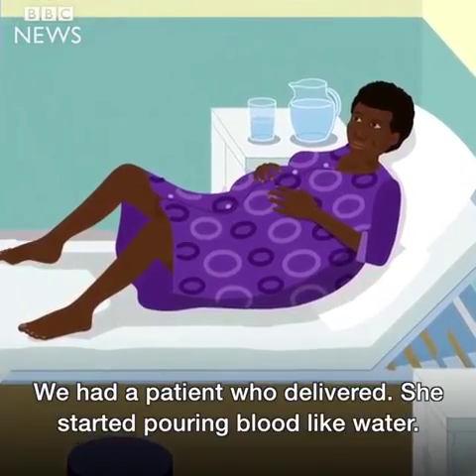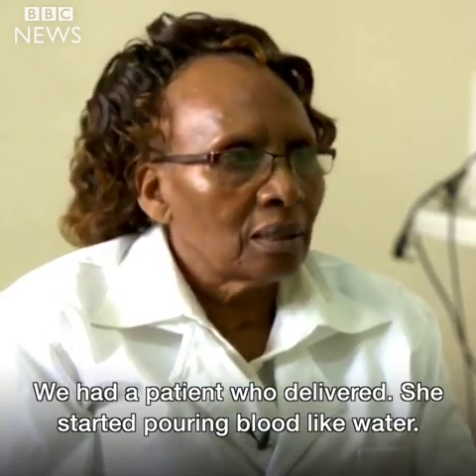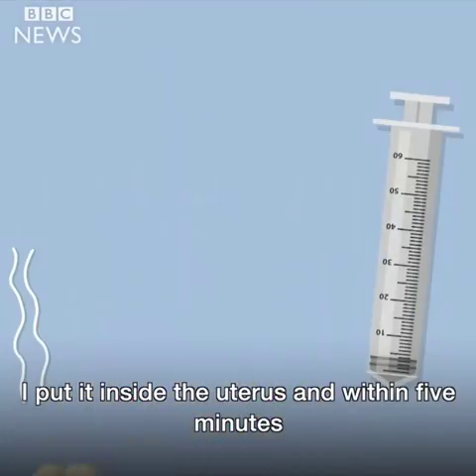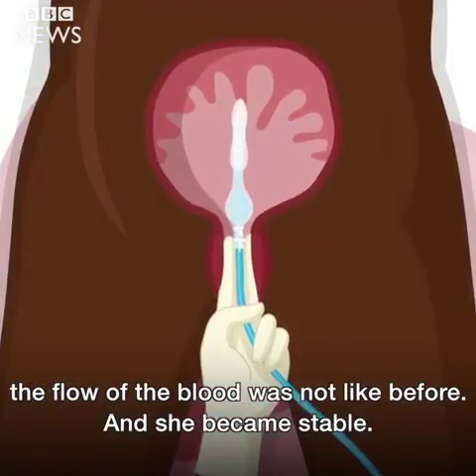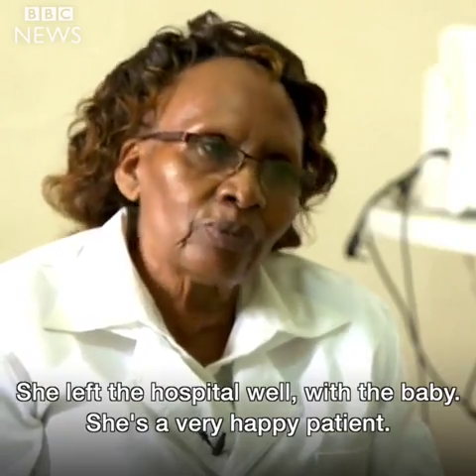We had a patient who delivered and she started pouring blood like water. I put it inside the uterus and within five minutes the flow of blood was not like before, and she became stable. She left the hospital well with the baby.